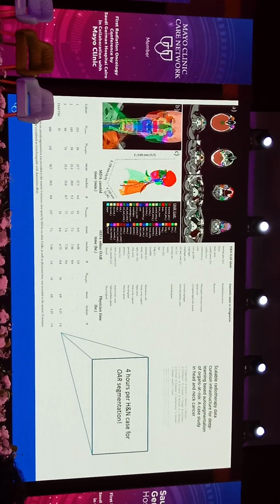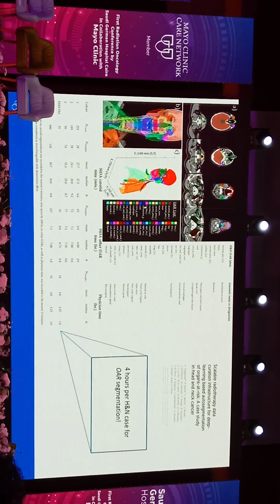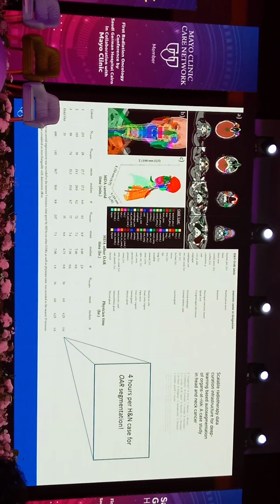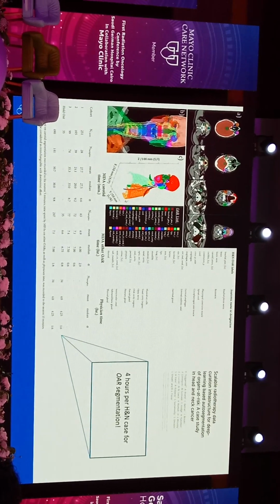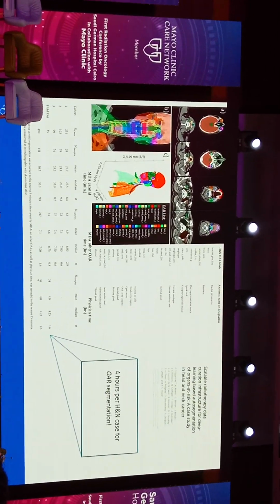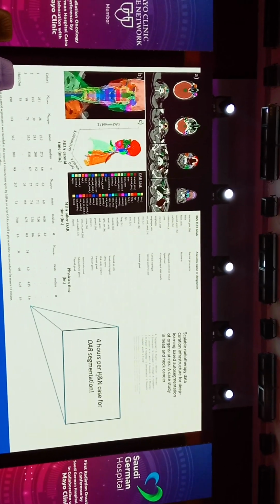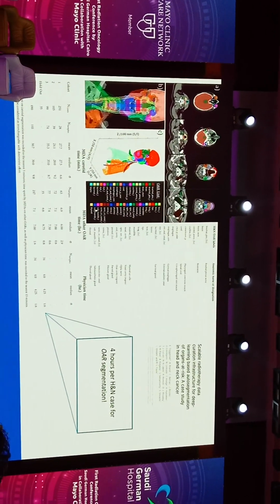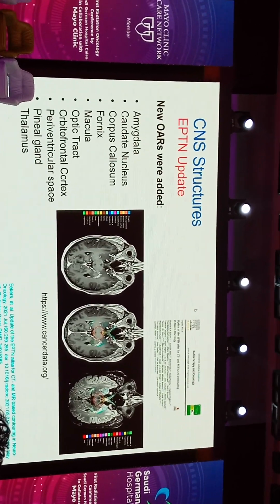When we looked at our own data in head and neck, there was a working group at Mayo that curated 42 OARs to be generated for auto-segmentation, and you can see a representation of them here. It took two physicians who contoured the gold standard 34 cases around 4 hours to segment out all of these OARs. So that's a ton of time per case if you're really going to detail each of these structures as potentially recommended.